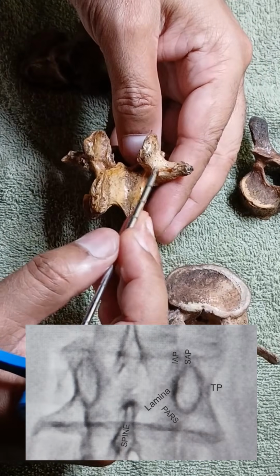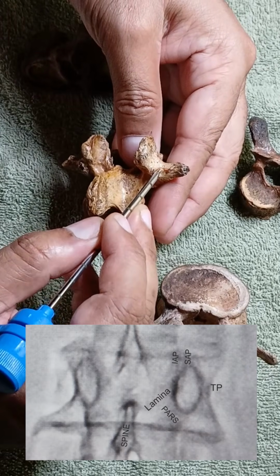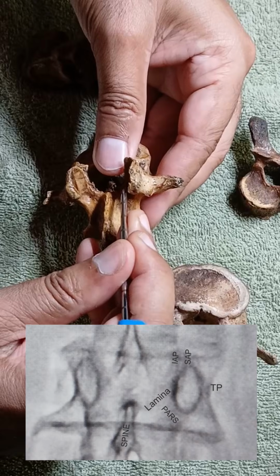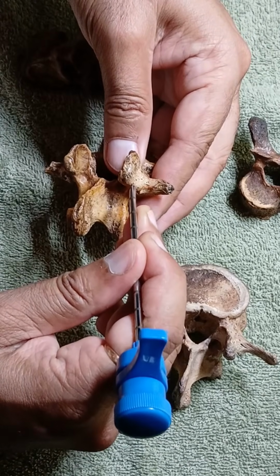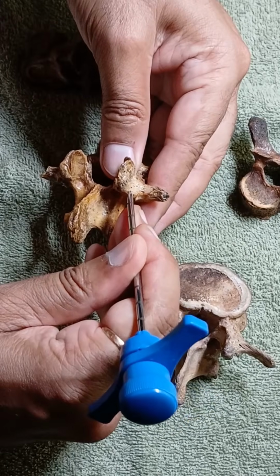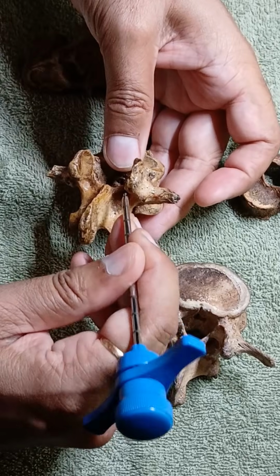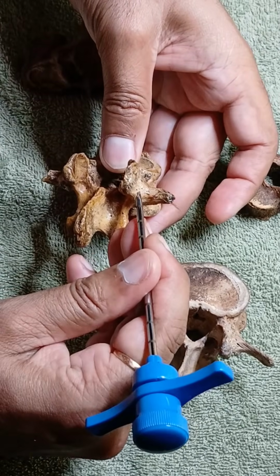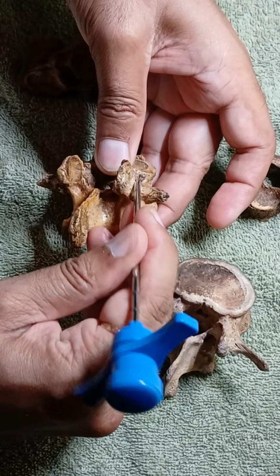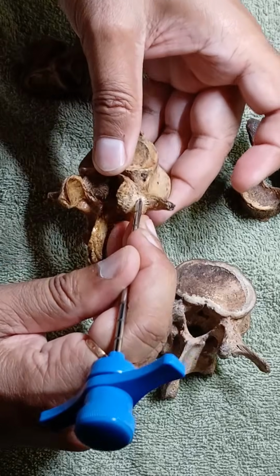Here is the accessory process, the mammillary process. So this area is not very smooth or round. We have to take the first bite or purchase in this irregular area, and that bone is also a little osteoporotic. So many times the needle slides this way, it may go this way. So the entry point is so important.